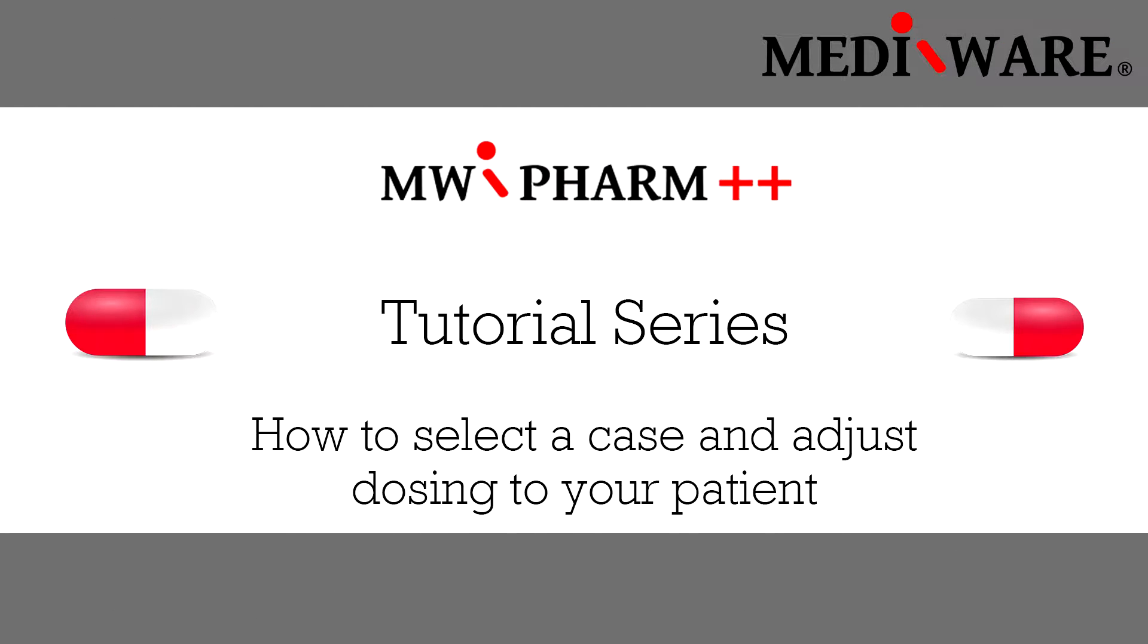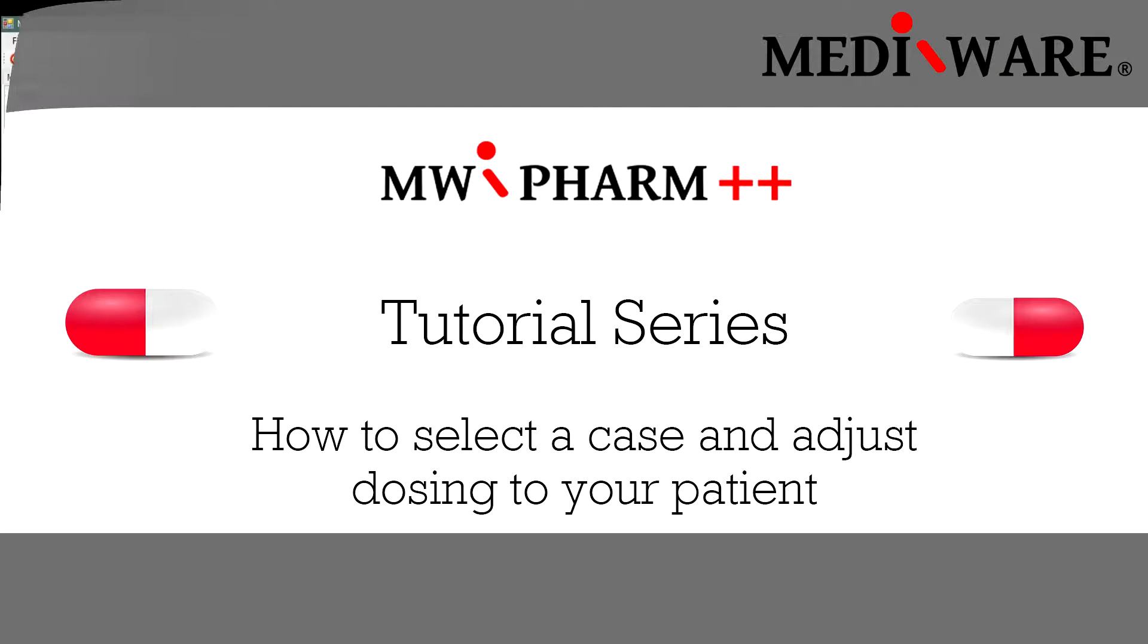Hello and welcome to our series of learning videos about our TDM software MWFarm++. The topic for this video is how to load drug models into your patients in case table, how to dose or adjust dosing and measurements in history tab, and also how to change the visual look of reports.